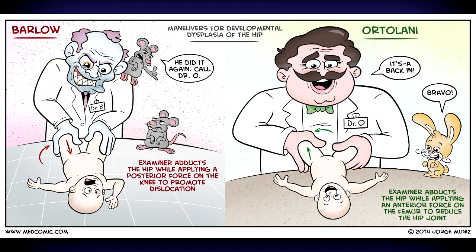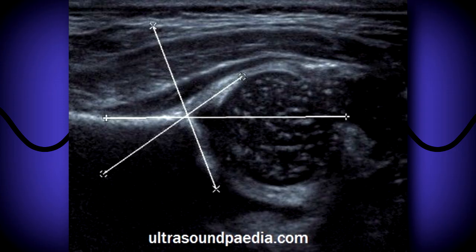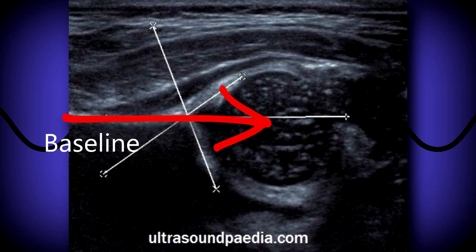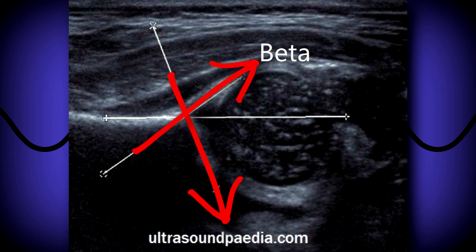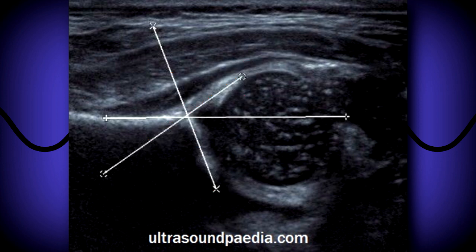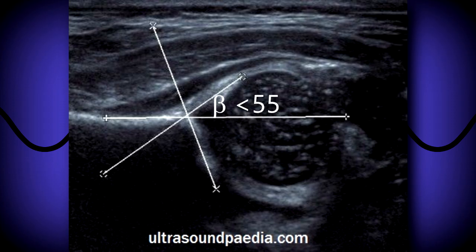We perform adduction and abduction of the patient's legs. These movements are called the Barlow and Ortolani maneuvers, and are done during physical examination by the pediatrician to rule out dislocation of the hips. This dynamic technique is invaluable as you can see subluxation in real time. While scanning, we also take a pair of measurements called alpha and beta angles of the acetabulum, developed by Graf. We draw a line across the ilium horizontally, then two other lines that dissect it through the acetabulum and labral areas. A normal alpha angle is 60 degrees or above, and the normal beta angle is 55 degrees or below.